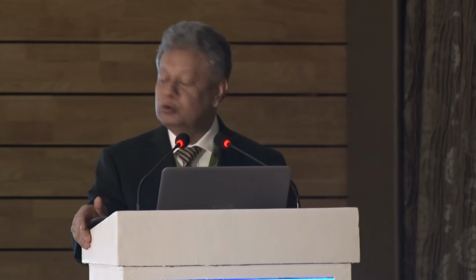Last, wound closure is important as well, because if we don't close the wound properly, there will be a chance of rotation by tilting of the lens. So wound closure is important. At the same time, we know that rotation usually happens 1 hour after surgery, so we ask the patient to lie down flat for 1 hour. If he does that, the chances of rotation become much less.